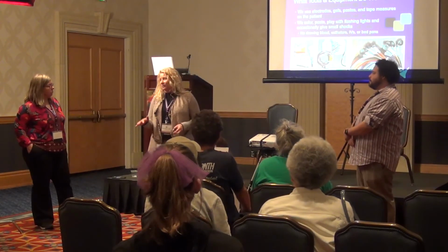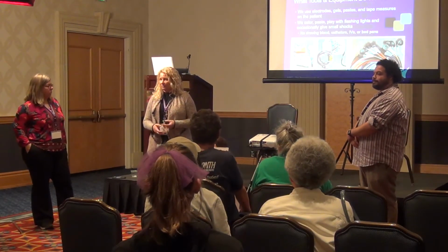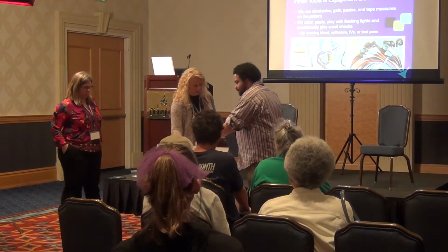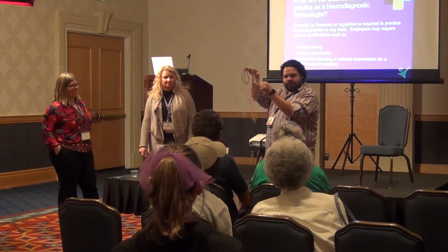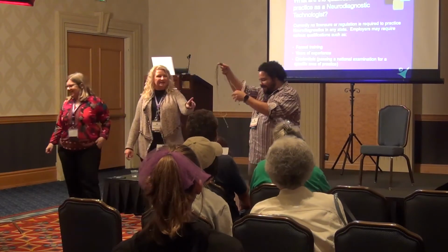Like we had said before, we're not shocking you, nothing's going into you when we're doing an EEG, whether it be short-term or long-term. And then Jay, do you want to go through any of this stuff? If anyone has any questions about it? So these are the tangle-resistant electrodes. I think that's the biggest challenge, right?